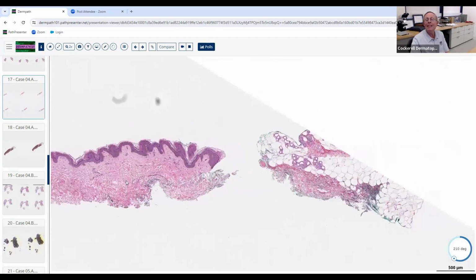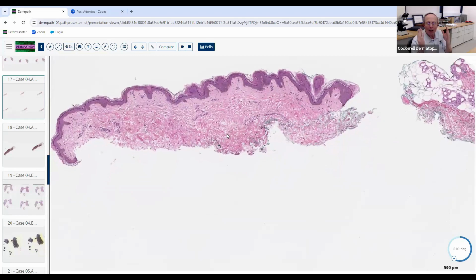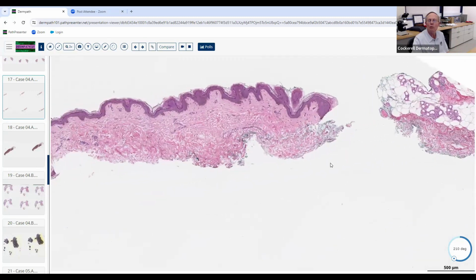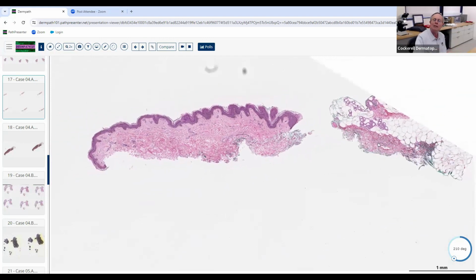This is an example of an anetoderma. When you're seeing an anetoderma, you usually need a punch biopsy, and you usually see the subcutaneous fat sitting up here. It kind of got separated here, so let's just pretend this was a deeper biopsy, and then the fat was sitting around in this area right over here. So that's what it looks like when you look at a low magnification of a real, honest-to-goodness anetoderma.